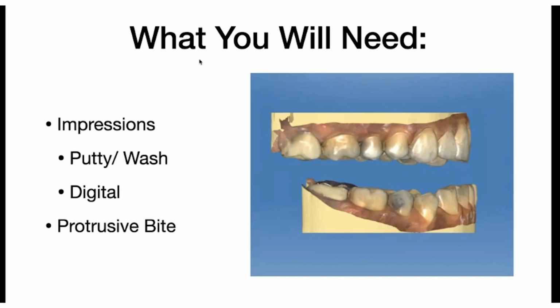It's very important that the lower appliance, not the upper, covers the distals of the mandibular second molars, so we don't see any tooth movement. If you don't cover the posterior of the mandibular second molars, you will see 18, 19, 30, 31 kind of spread apart.